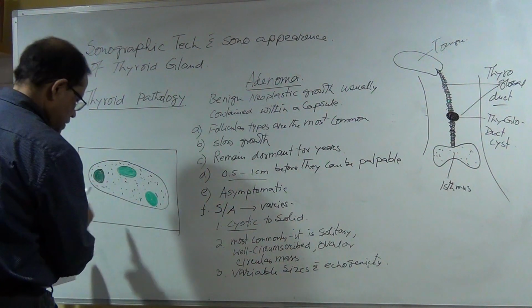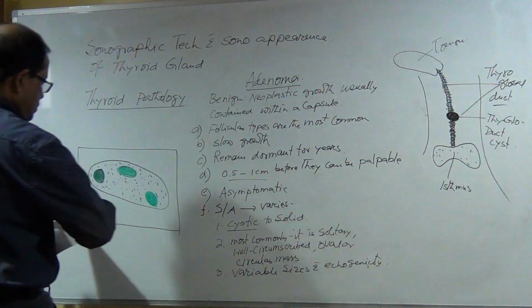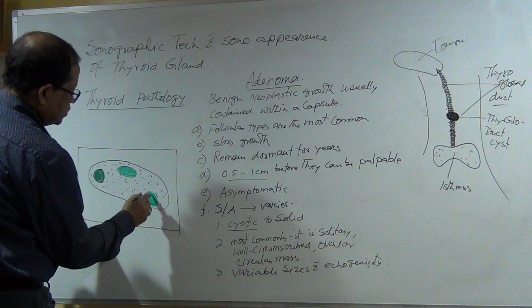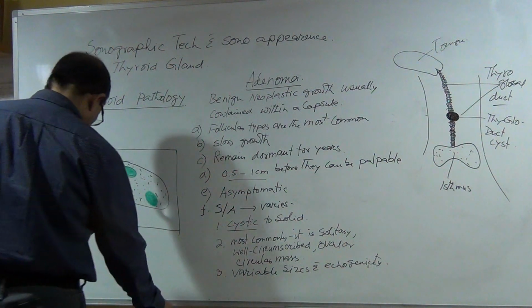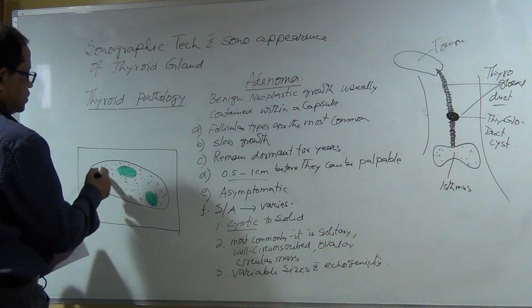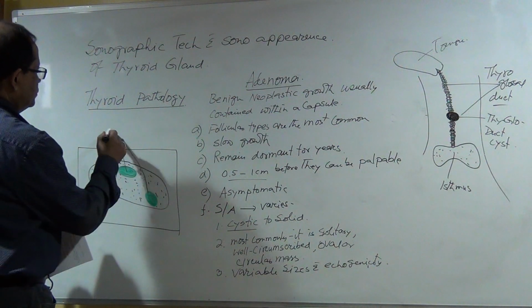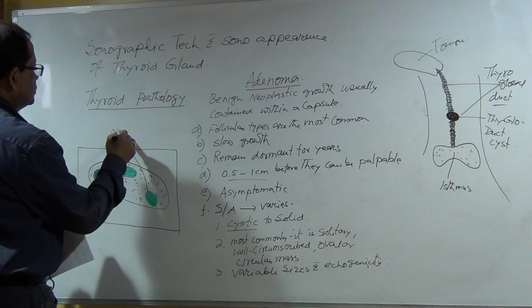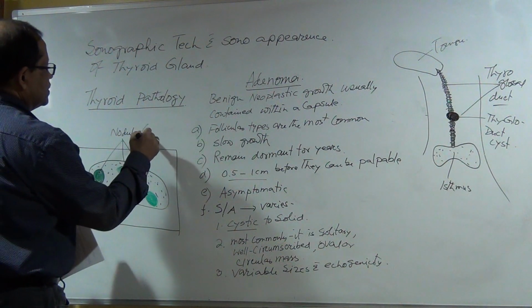Okay, echogenicity, you will see there is a variation of echogenicity too. Okay, so this is the nodule. We call it adenoma.